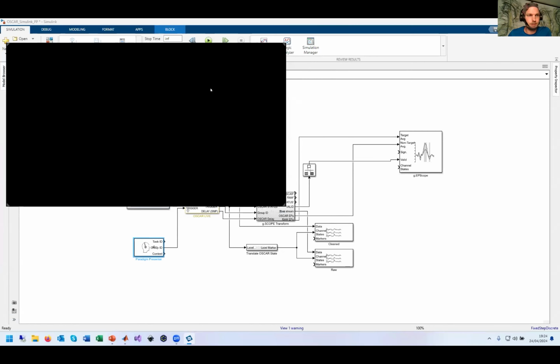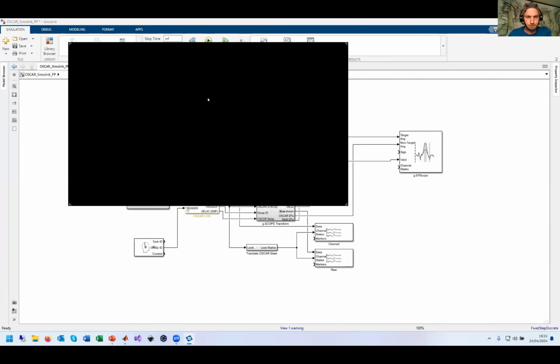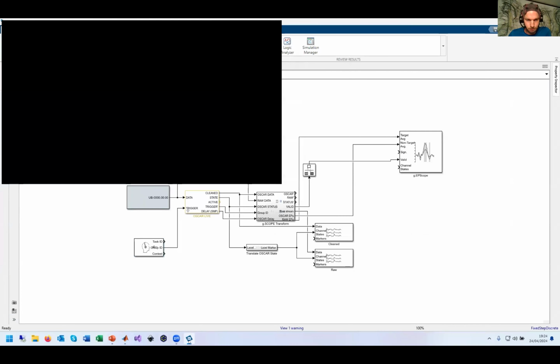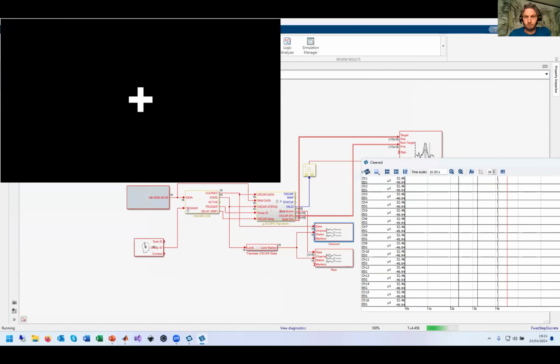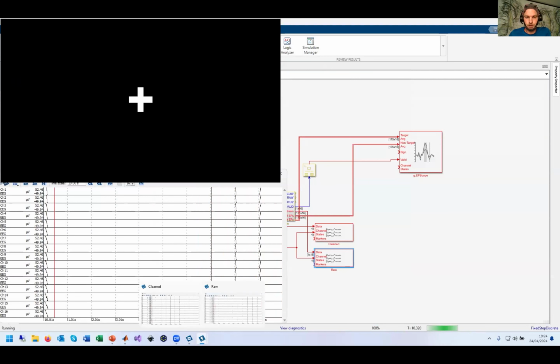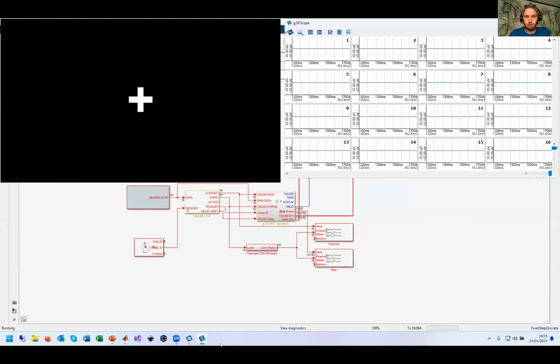And here in this case, even if I don't really concentrate on that image, we will see that as a visually evoked potential. So let's see if that works. The paradigm is loaded. Let's start. We have a few scopes again. So I will do this experiment now, and you can have a look at the EPs that are generated.